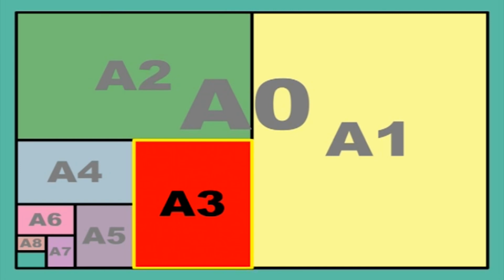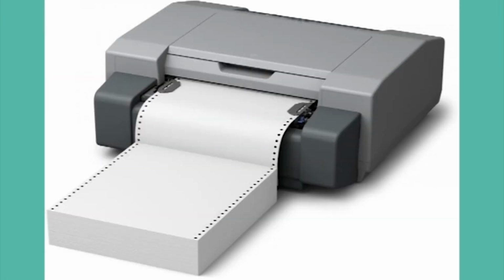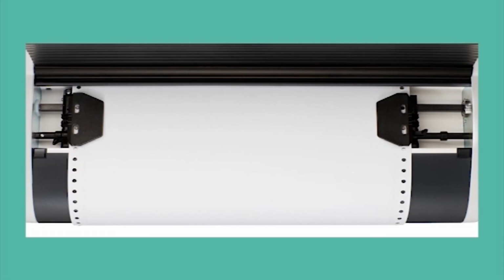The standard Braille paper sizes are 8.5 inch by 11 inch and 11 inch by 11.5 inch. Braille paper is also available in 3 different layout formats: continuous, cut sheet, and rolls. Continuous paper is used in tractor-fed printers. This paper has holes on its edges that enable it to be fed through the printer and is connected to the next sheet of paper at the top and bottom.